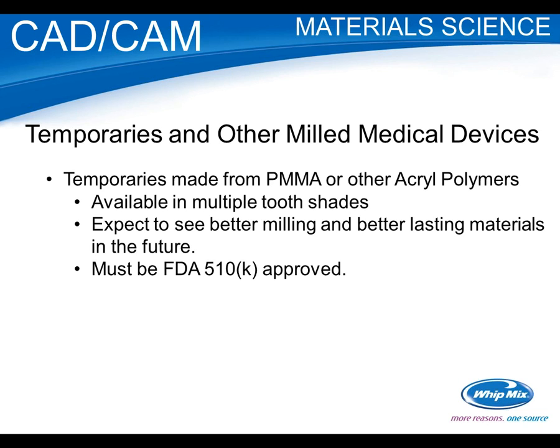I think we are going to be seeing better milling and better lasting materials in the future. Again, I don't think PMMA is one of the best for milling, but now that it's starting to move and there's getting to be some volume in sales here, I think you'll see a lot of other manufacturers finding better materials to fit this niche.